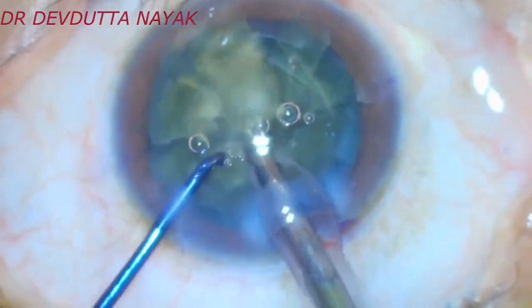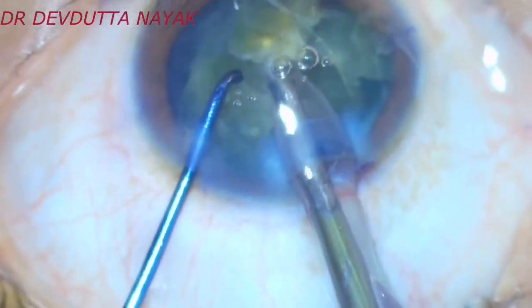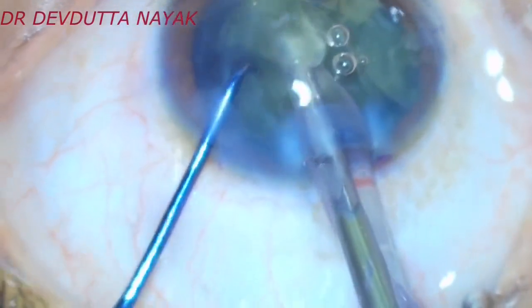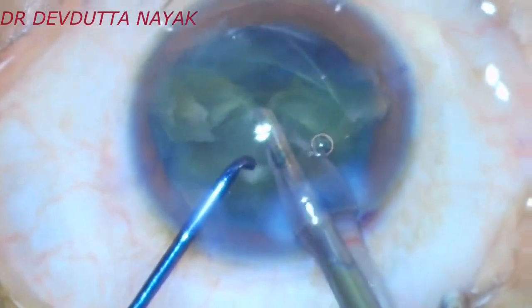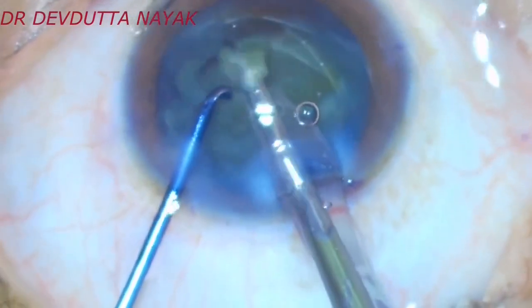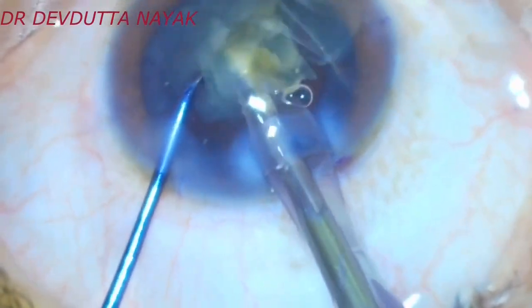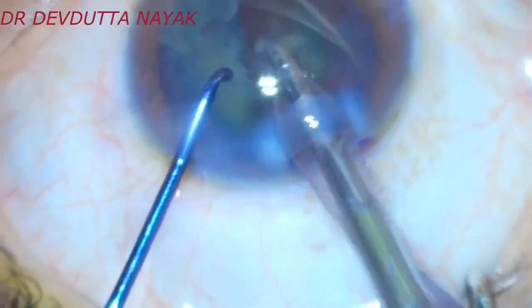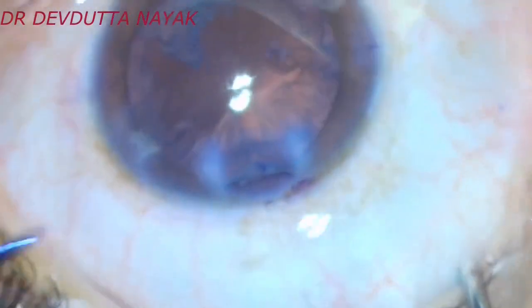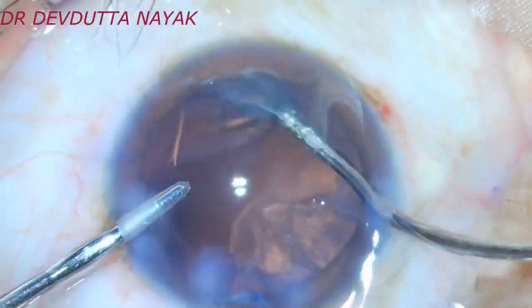This is the endonucleus being removed, and now we can see the loose pieces are coming very easily to the phaco tip. This is the intact posterior plate, so we emulsify at the center and then again proceed to remove the loose pieces. The phaco has to be conducted at a safe mid-pupillary zone and in a supracapsular or iris plane. So now the nucleus has been totally phacoemulsified. We proceed to do the bimanual irrigation aspiration to remove the cortical remnants.